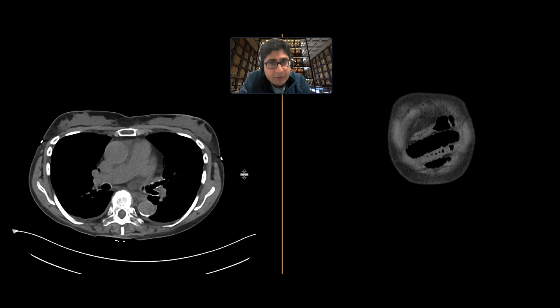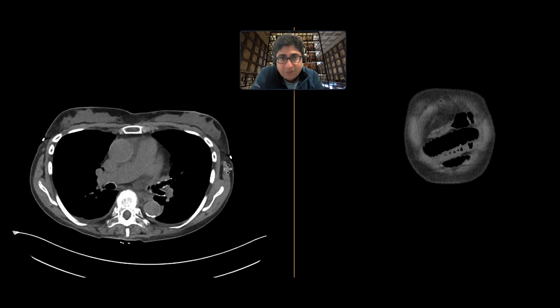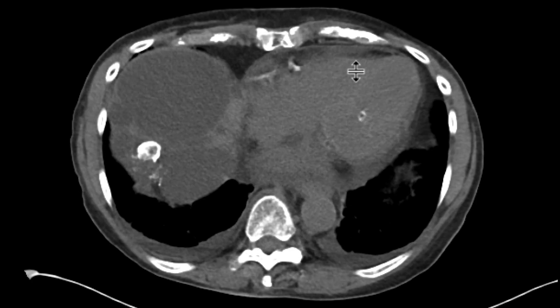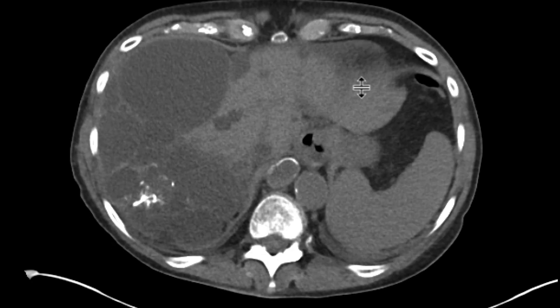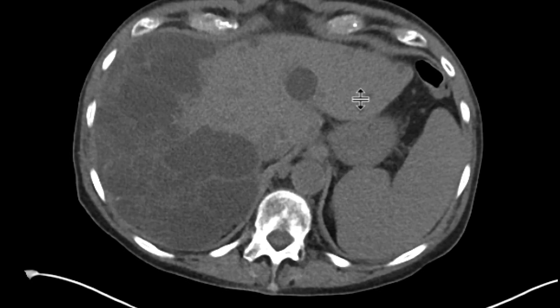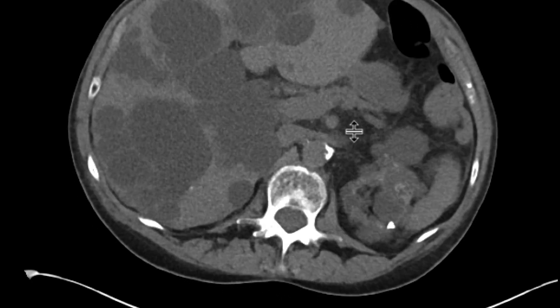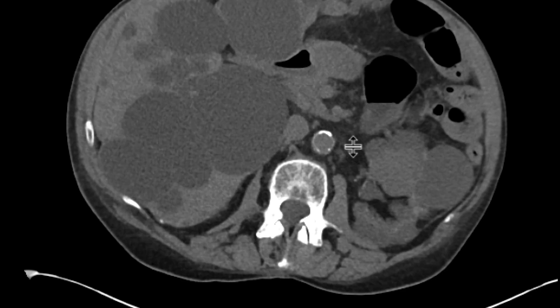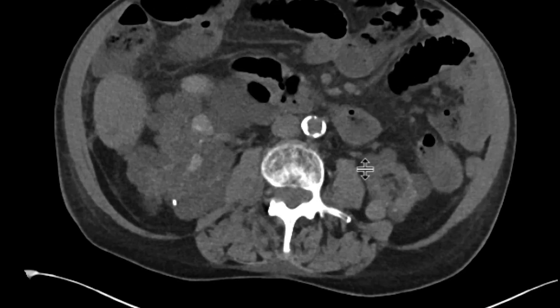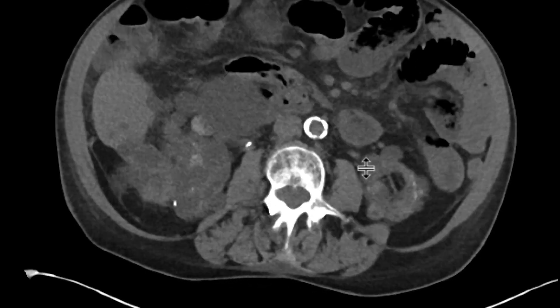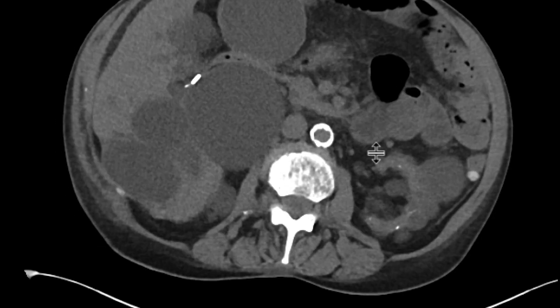This is a patient who comes in with right lower quadrant pain and gets a CAT scan to evaluate this. As you look at the CT scans performed in this patient, we can immediately see that there are numerous cysts throughout the liver. Some of them have peripheral calcifications. We can look at the kidneys, and there are numerous cysts in the kidneys.